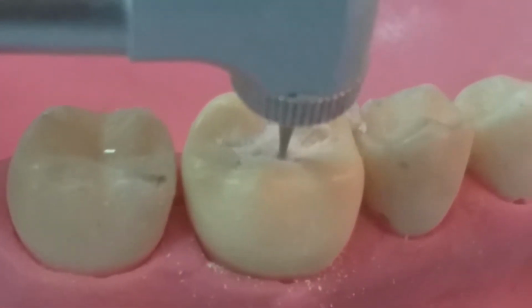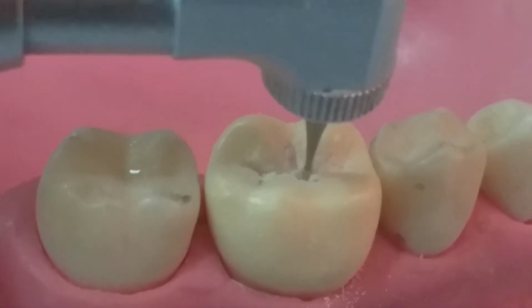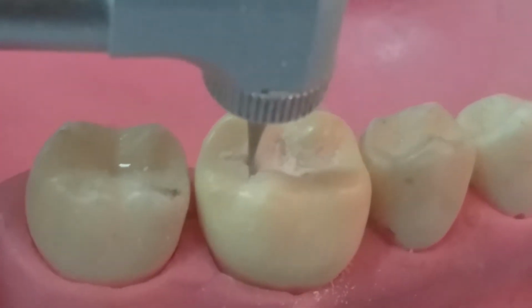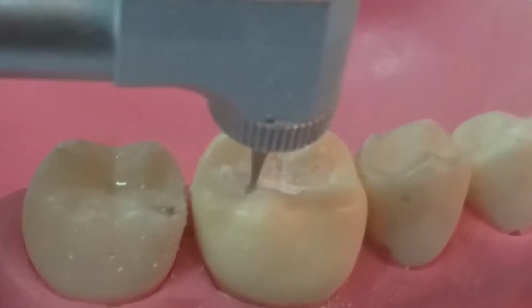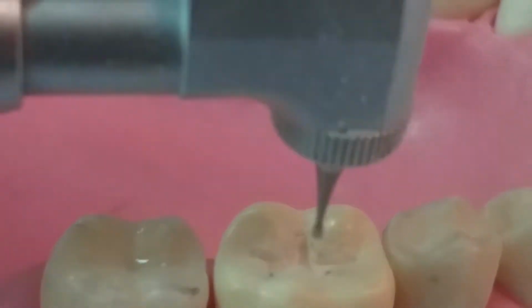Like here, we are using our inverted bur, and we should make all the cavity depths, mesial, distal or the center depth, all the same, 1.5 millimeter.